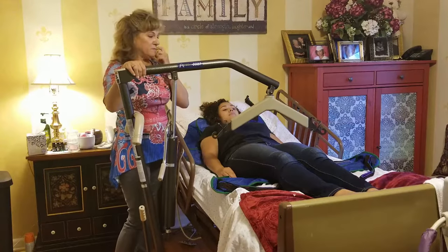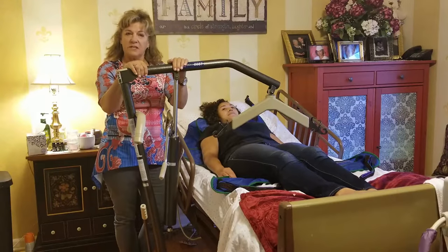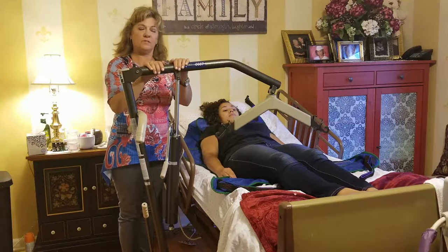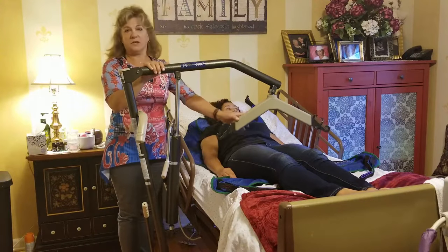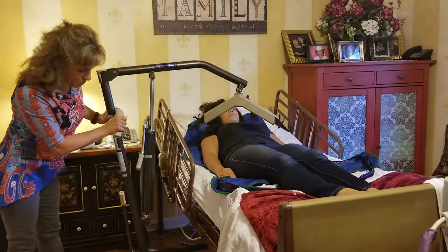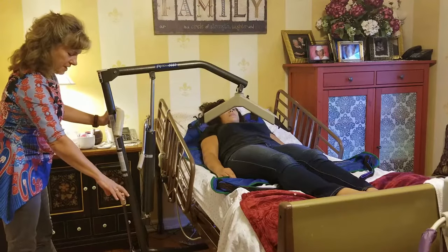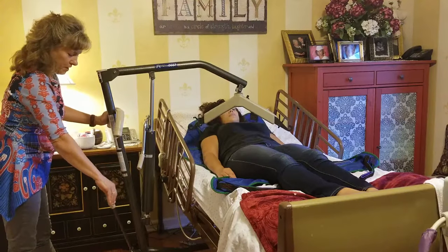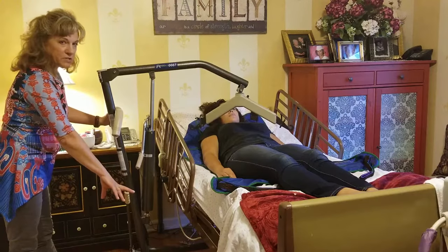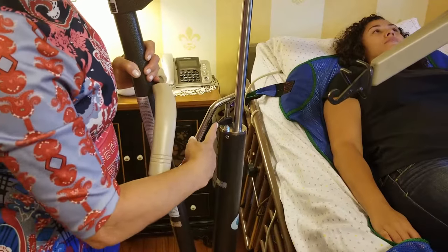I've been using Hoyer lifts for at least 15 to 20 years and they haven't been recalled, so they're a really good device to have. You don't need one when a person first comes home if they're walking, but if they need more help as time goes on, you progress to getting a Hoyer lift. The lift has wheels on the bottom that go under the bed, and a handle near the floor that opens the legs apart to give more stability.